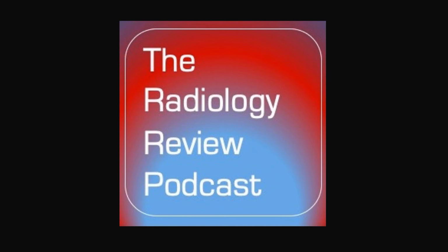Welcome back to the Radiology Review podcast, your on-the-go source for radiology board review. On this episode, I will be presenting what may be the most requested topic I have had to date, and this topic is Name That Nuclear Medicine Scan. For those of you that are in the midst of ABR core exam study, you know the classic question that requires you to name the nuclear medicine scan or radioisotope simply by looking at an image.